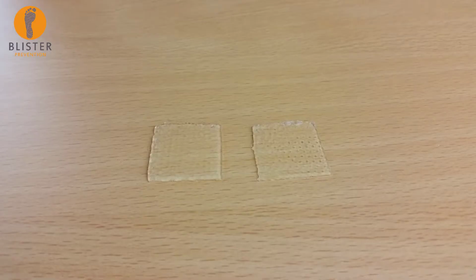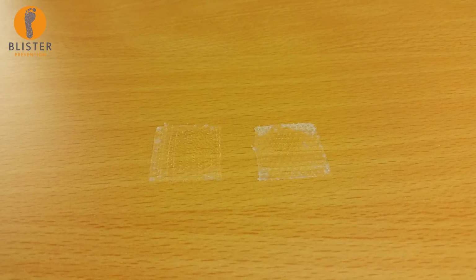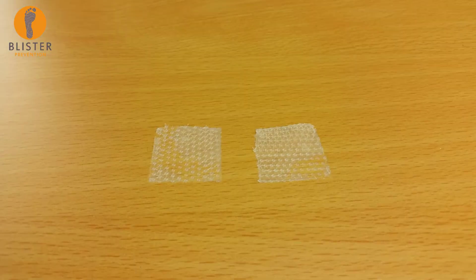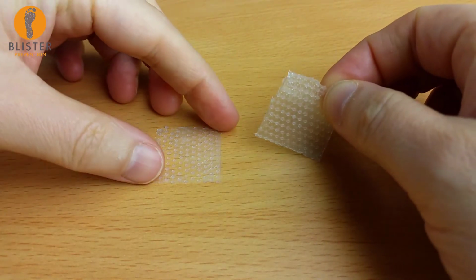Fourth, they dry out, and as they do, they lose their favourable properties from the gooey jelly thickness. When they dry right out, they just look and feel like a rough, thin plastic sheet. At this point, they are more of an irritant than anything else.